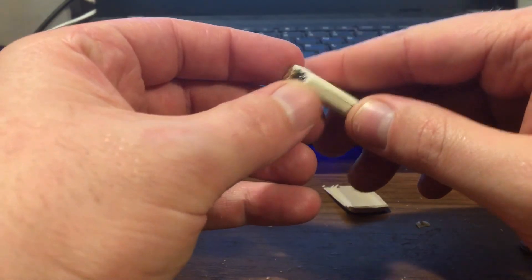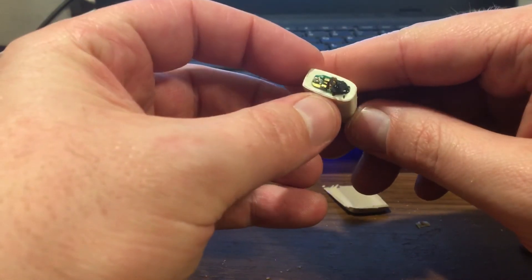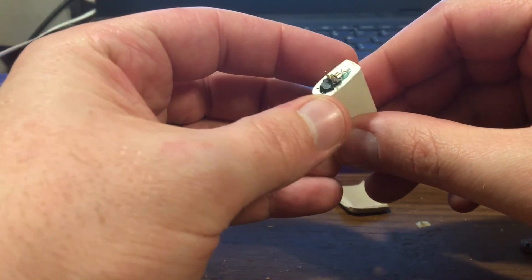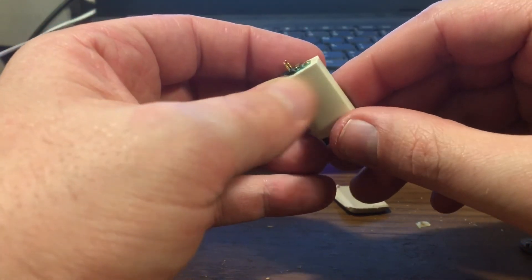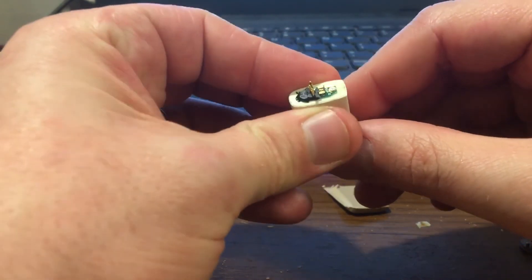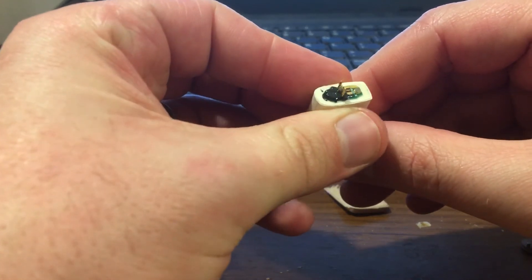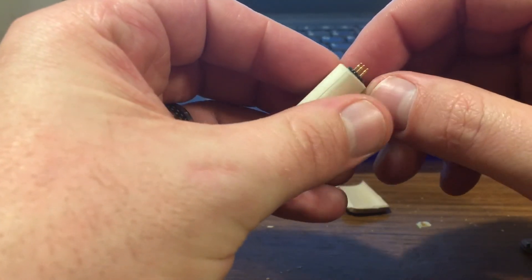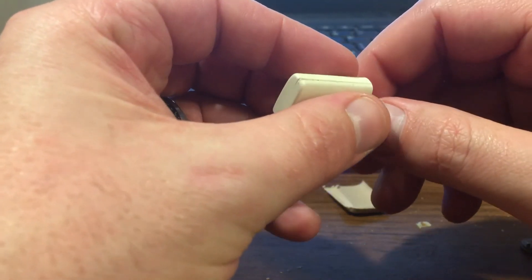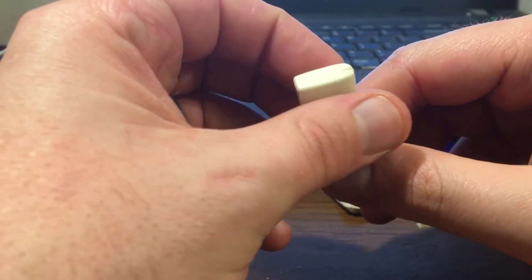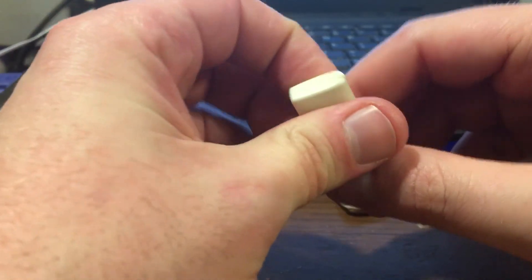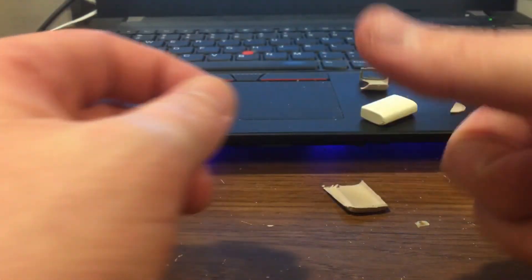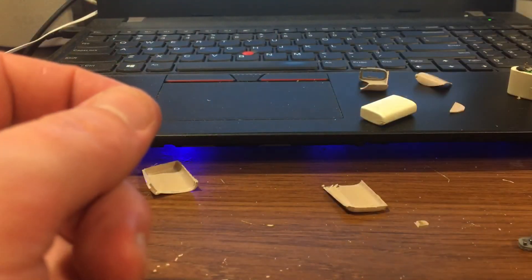But yeah, that is ultimately a battery teardown for the Nucleus, for the Nucleus 6. I'm not getting any further into it than this. Anyways, have a good one, folks, and catch you later.